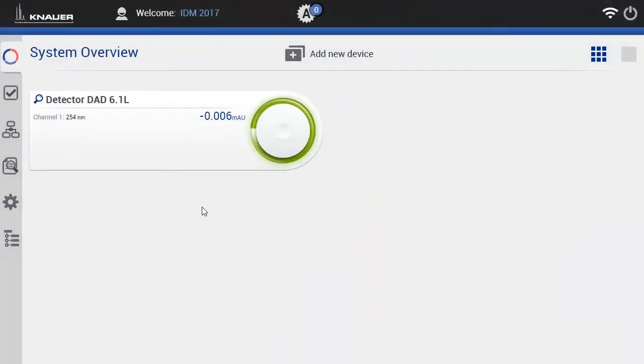In this tutorial we would like to show you how to change the IP address of a Knauer instrument via mobile control.